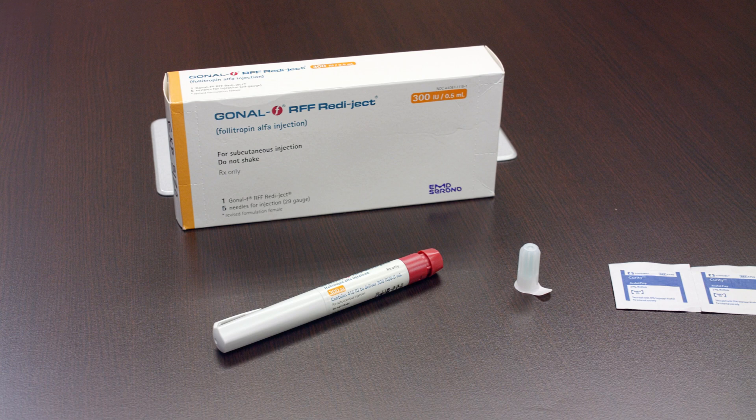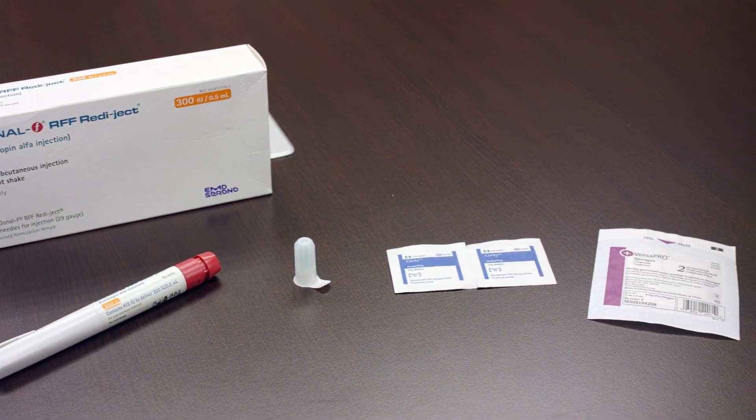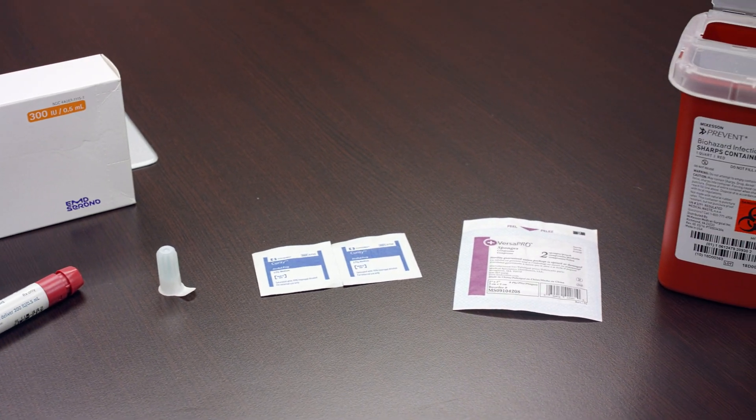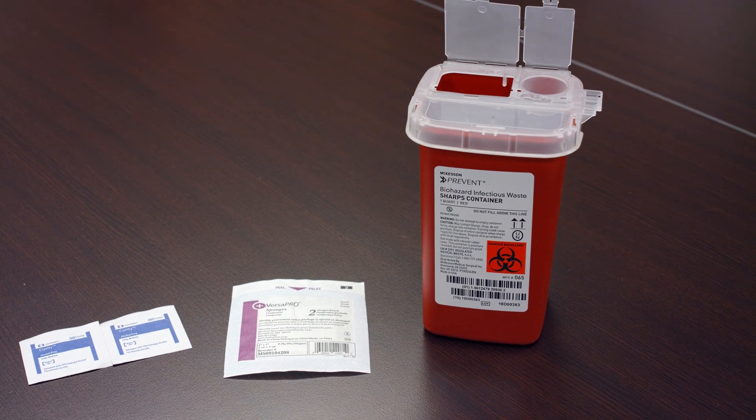First, you will need the following: a Gonal F RFF Readyject pen, a disposable needle that comes with the pen, alcohol swabs, sterile gauze, and a sharps container.